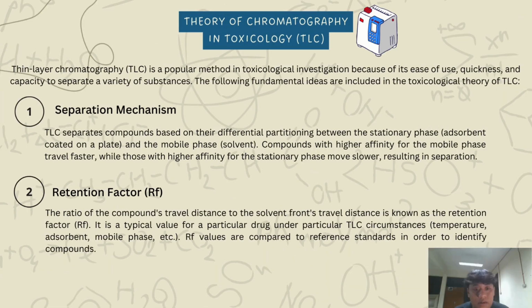Okay, so hi, my name is Danish Hakim. I would like to explain to you guys about the theory of chromatography in toxicology (TLC). Thin-layer chromatography (TLC) is a popular method in toxicological investigation because of its ease of use, quickness, and capacity to separate a variety of substances. The following fundamental ideas are included in the toxicological theory of TLC.